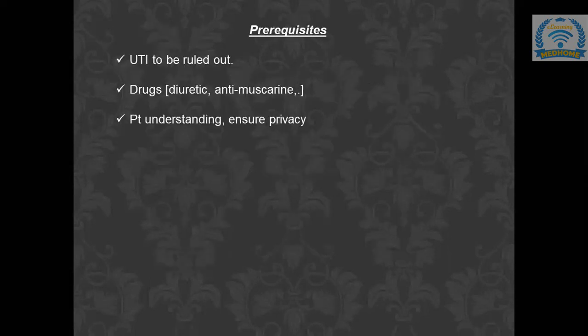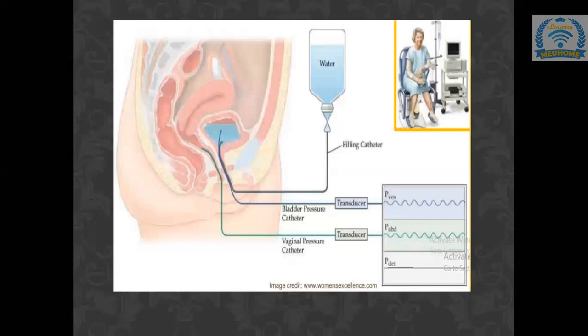Now, how would we proceed ahead with how to do urodynamics? It's not part of the exam; you will never be asked how to perform urodynamics. But it's very important, as we go through the next few slides with the graphs of urodynamics, to understand how we go ahead with it.